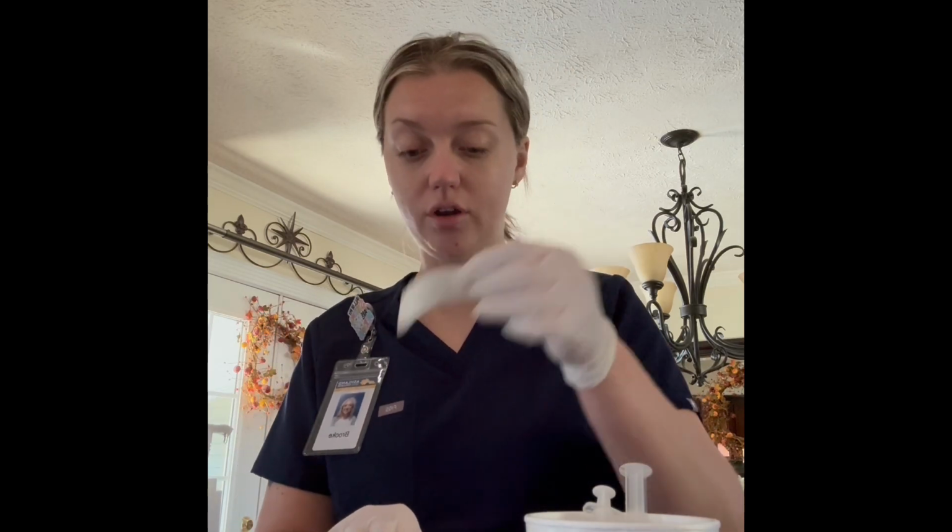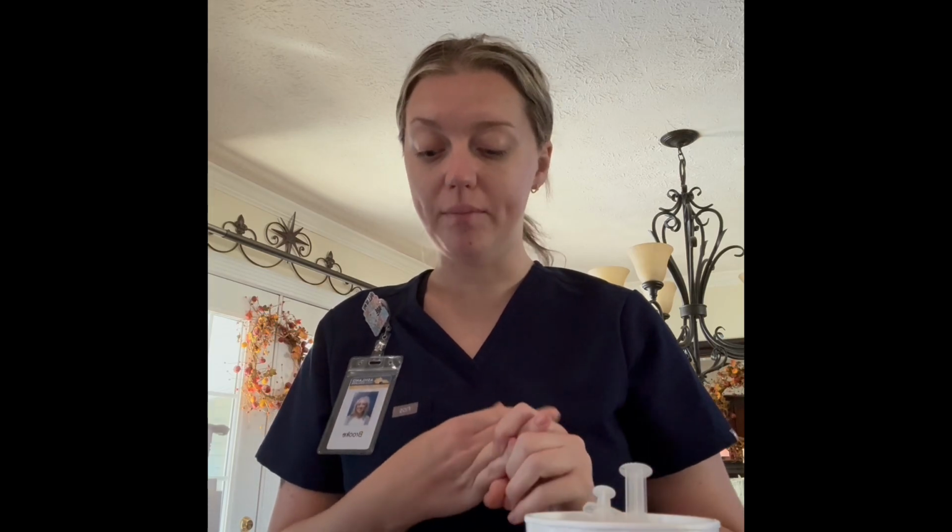After the site has stopped bleeding, I would cover with tape or a bandage, and then I would remove my gloves. I would report and record in the patient's chart that I have administered the medication. I'm applying hand hygiene as well right now, but I would report and record after that, and then I would perform an evaluation in the appropriate time frame based on the medication I have administered to my patient.